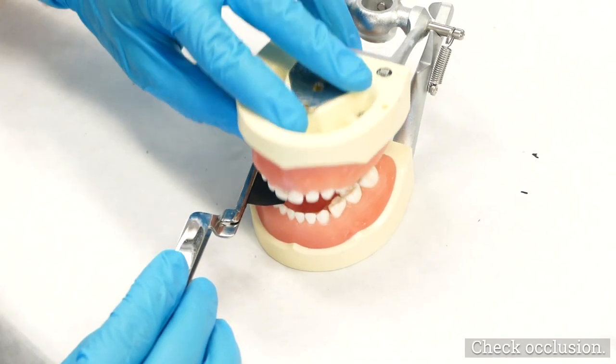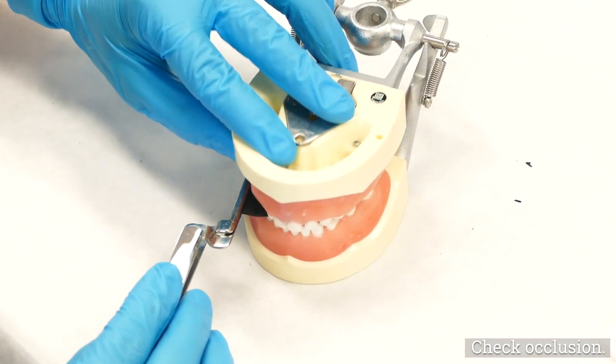If adjacent MO and DO amalgam restorations are being performed, they should be filled simultaneously.